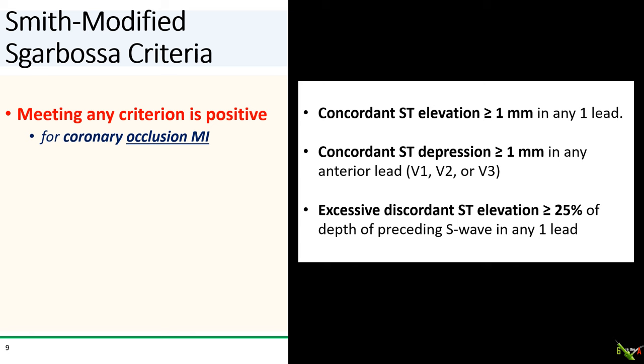Smith and his colleagues came up with three criteria for coronary occlusion MI. First, concordant ST elevation of 1 mm or more in any lead. Second, concordant ST depression of 1 mm or more in any anterior lead. Third is excessive discordant ST elevation — meaning if the size of the ST elevation is more than 25% or more of the size of the S wave, then it is considered excessive.